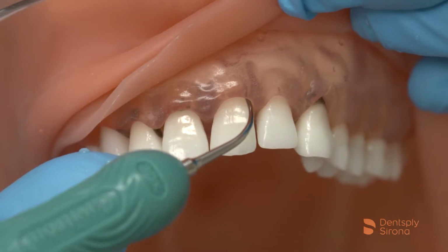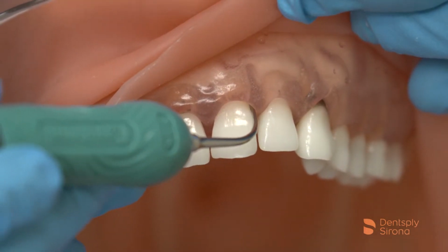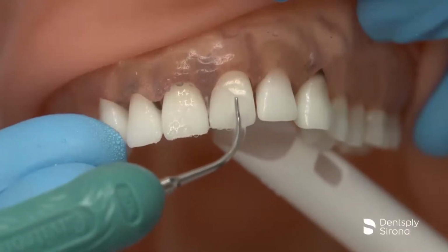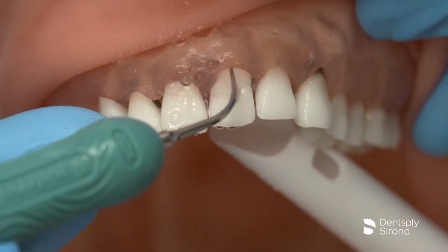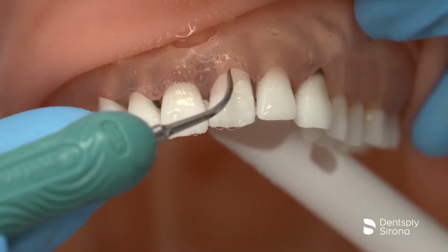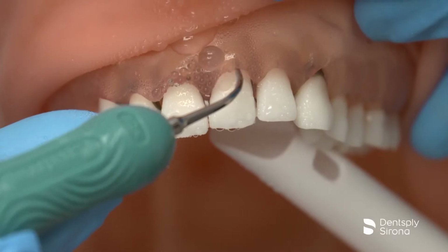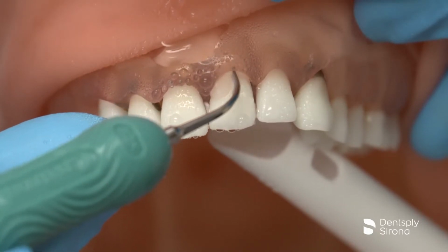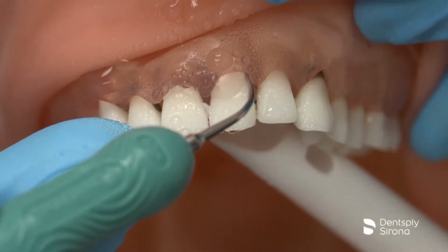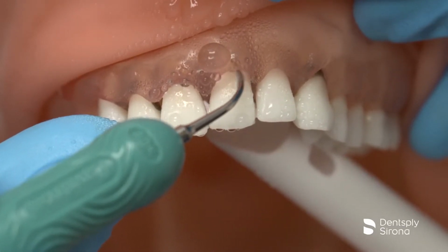As the clinician enters the sulcus, it is essential to assess the anatomy as the insert travels to the base of the pocket. If calculus is encountered, the clinician engages the terminal end of the deposit in a light tapping approach, followed by small sweeping strokes to provide lavage and assess the removal. It is imperative to ensure the complete removal by producing a stroke pattern that is overlapping and methodical.